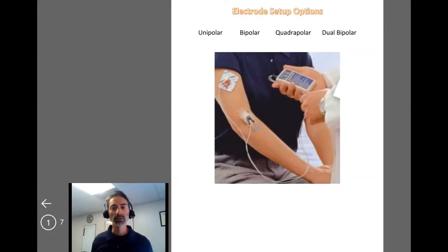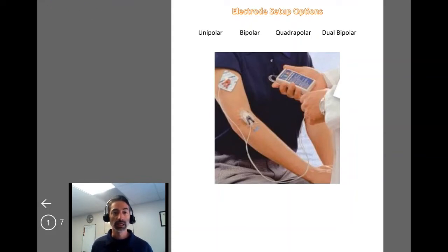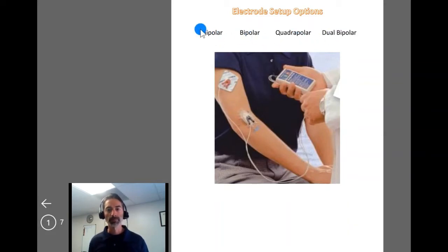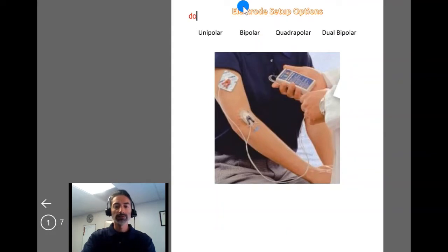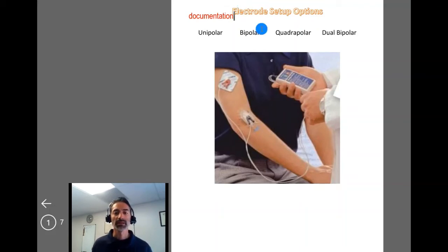Let's talk about electrode setup options and the different things you're going to include in your documentation. The terms unipolar, bipolar, quadrupolar, and dual bipolar are types of documentation you might use when describing your electrode placement and setup in your notes.